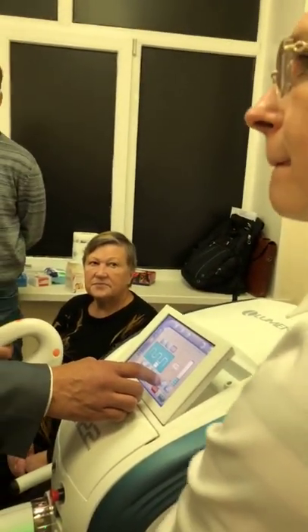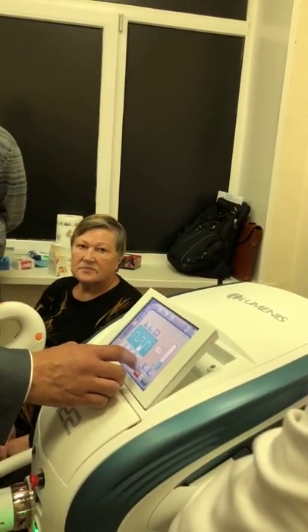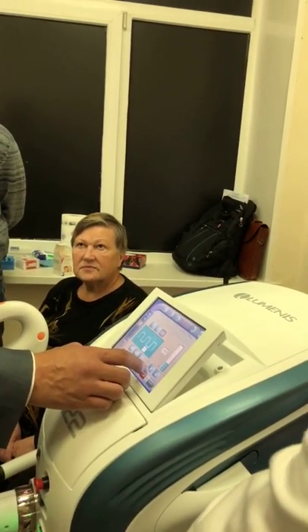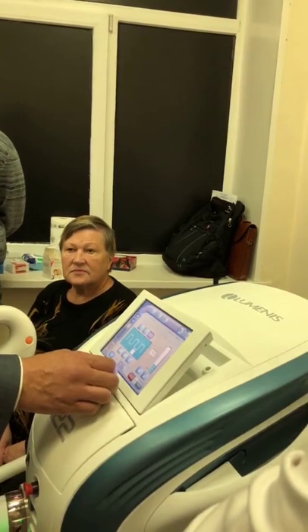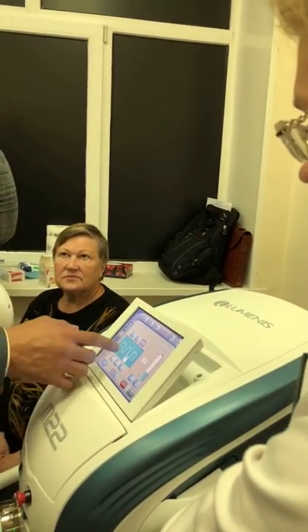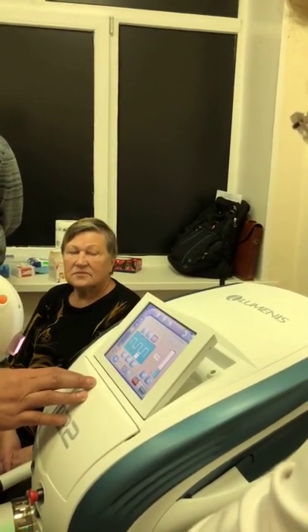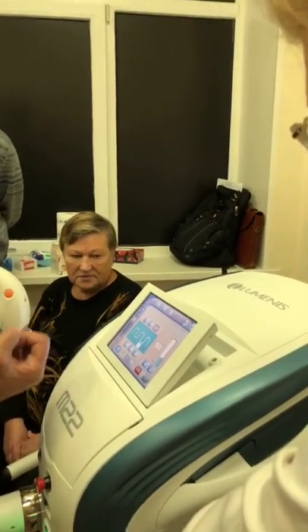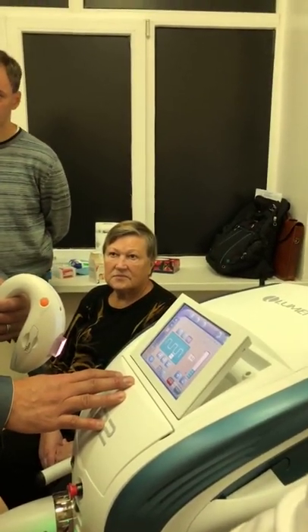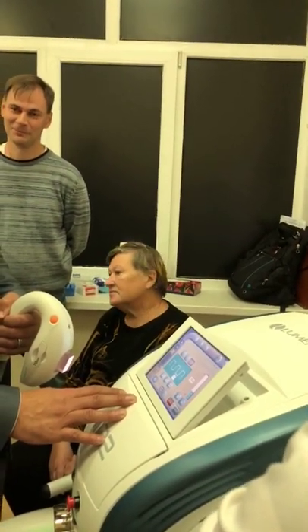6 миллисекунд это импульс, и можем слушать 14, потом паузу 50 миллисекунд, чтобы охладиться, и, соответственно, дальше. Можно разные выбирать на один импульс, на двойной импульс и на тройной. Все как бы индивидуально подбирается, по времени можно регулировать. So the advantages is you have the chilling plate, you can go multi-pulse, and then you can control the parameters in terms of milliseconds of pulse versus milliseconds of thermal relaxation time. Мы можем контролировать все параметры. Для того, чтобы охладить, можно тройной импульс использовать.